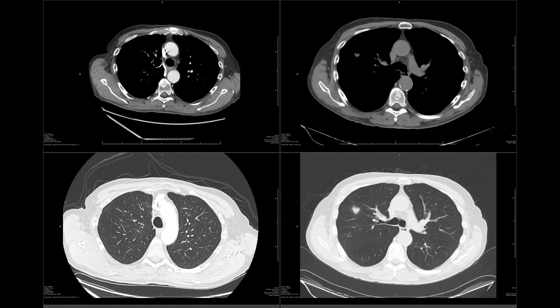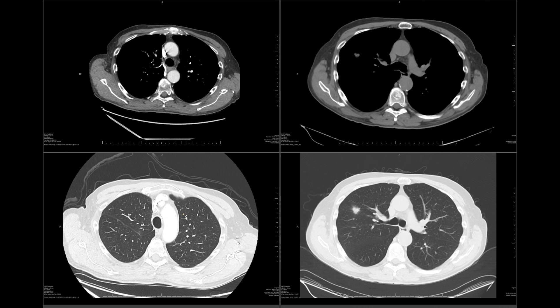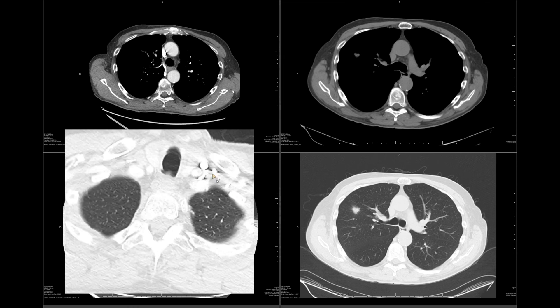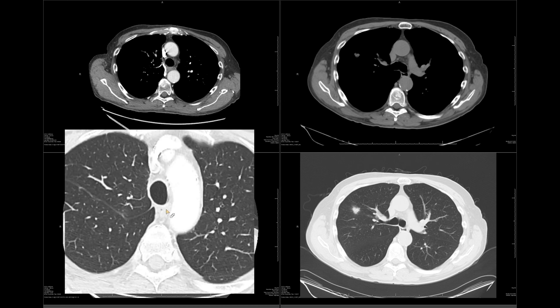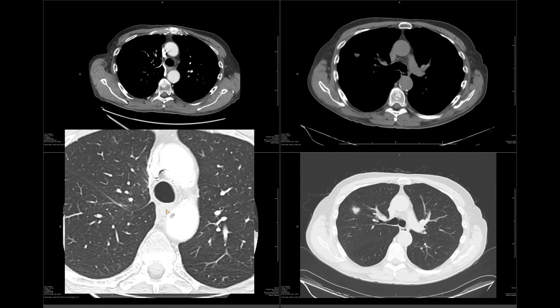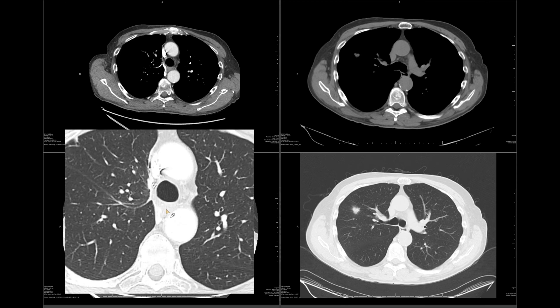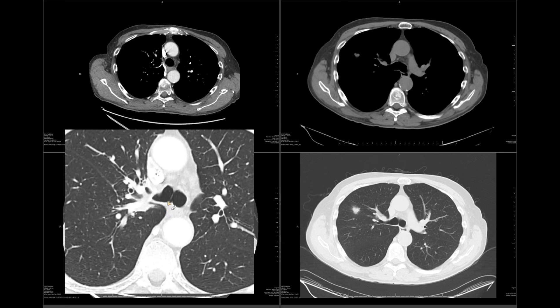Here's the first example, which is a right upper lobectomy. The two images on the right are from the preoperative CT, and the two images on the left are from the postoperative CT. Let's start with the trachea and follow it down. This right here is the trachea, and as we scroll down we run into the carina and right and left main bronchi.